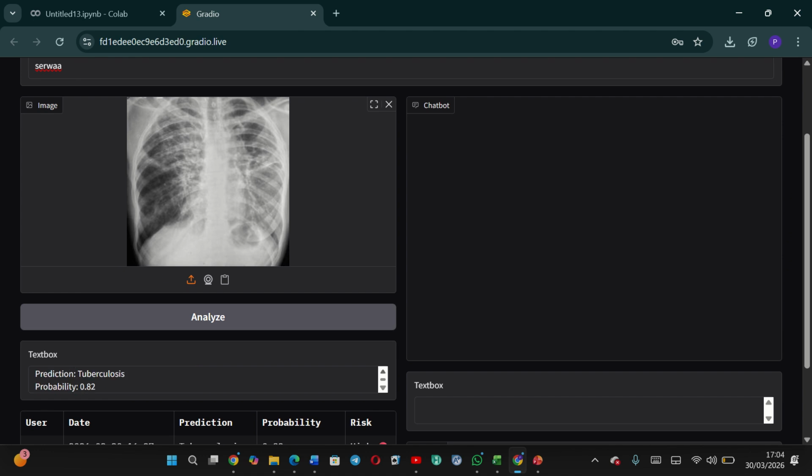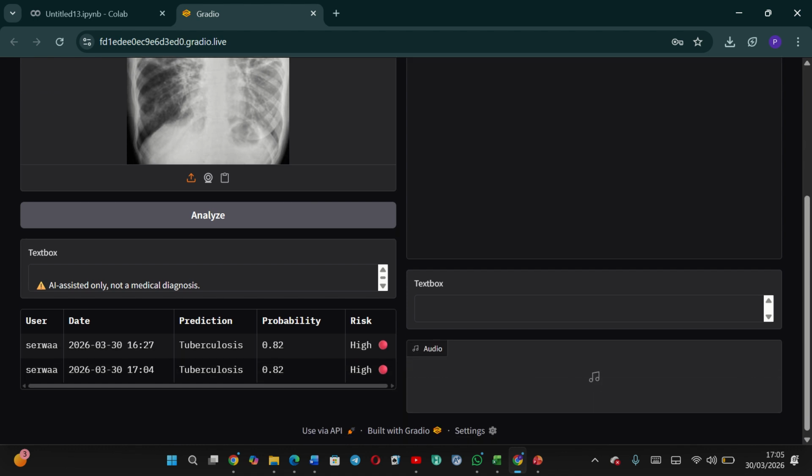This is an AI report. The prediction says tuberculosis. The probability of tuberculosis is 0.82, which is high risk. Then it gives you a warning that it's AI assisted only and not a medical diagnosis, which basically means you should not rely solely on it. Consult a professional medical doctor.